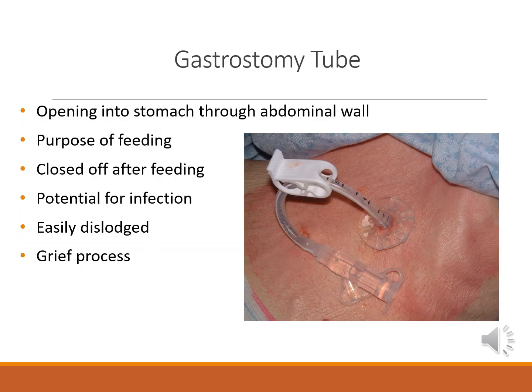A gastrostomy involves surgically creating an opening into the stomach through which a tube is placed from the stomach to the outside of the abdominal wall. This tube allows for feeding patients who cannot eat by mouth, and it can be used temporarily or permanently. The tube is secured either by sutures or a crossbar that keeps it in place against the stomach wall.